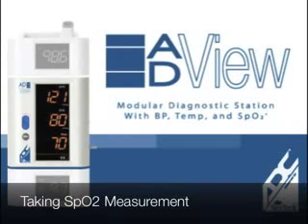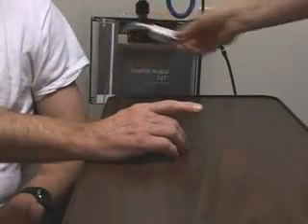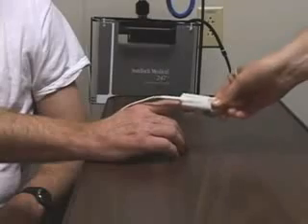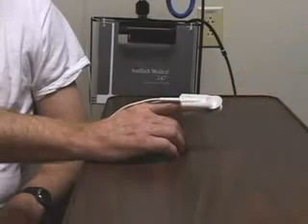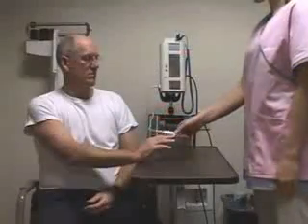To take an SpO2 measurement, start by inserting the patient's digit into the sensor. Note there are specific sensors for children. A traveling dash will display for 10 to 20 seconds until a reading is displayed. When a reading is complete, remove the sensor and return it to the unit.